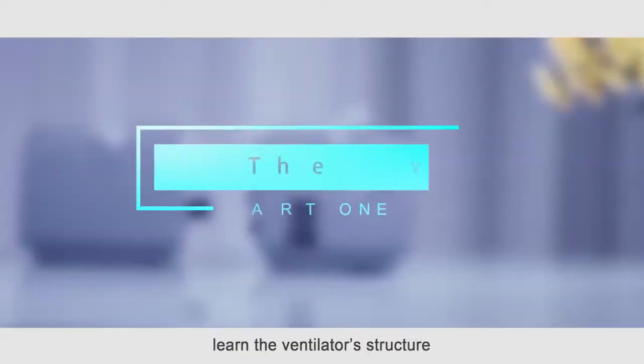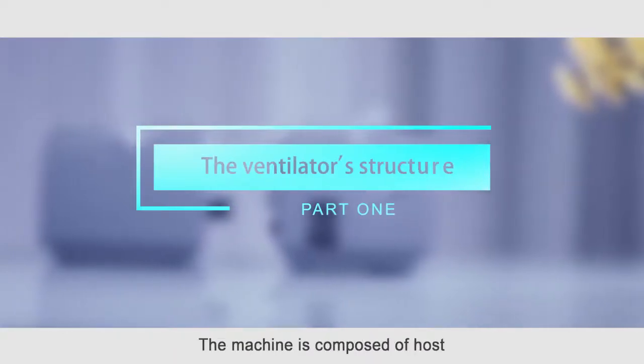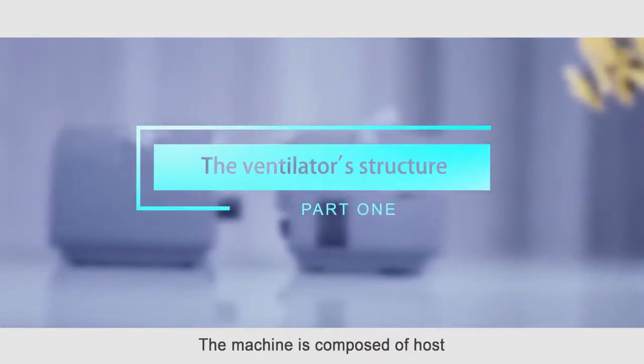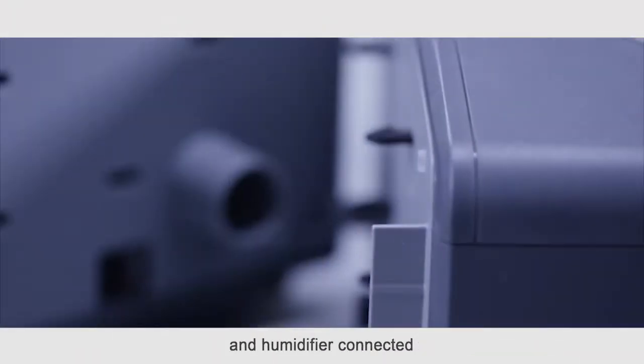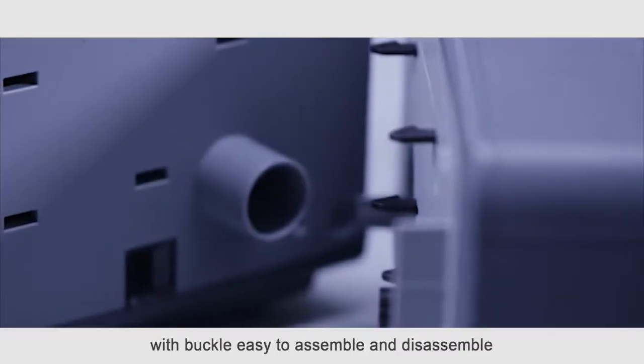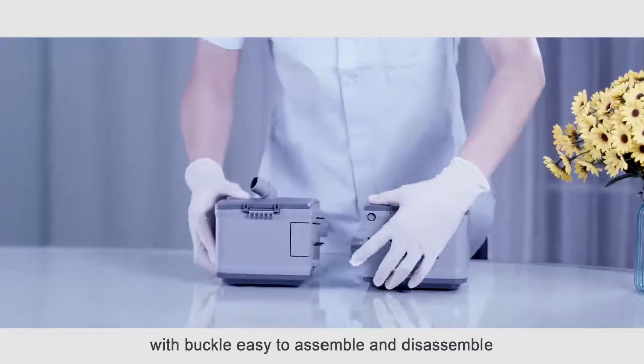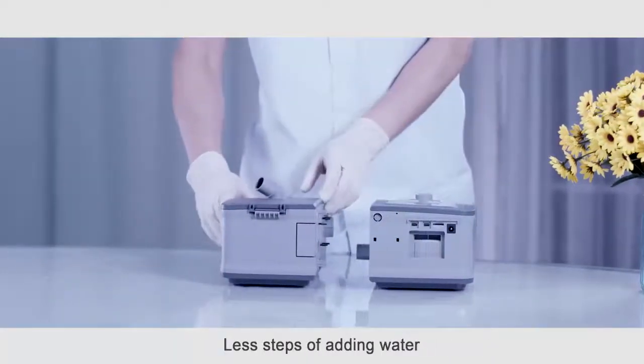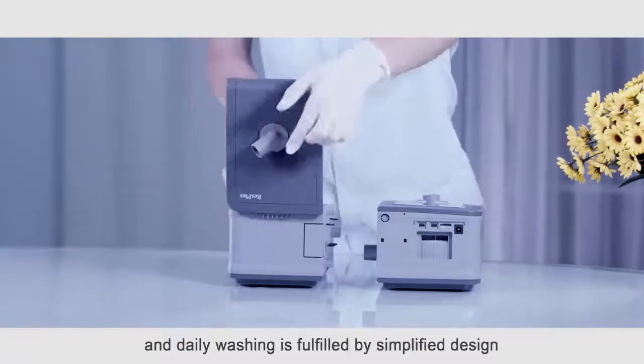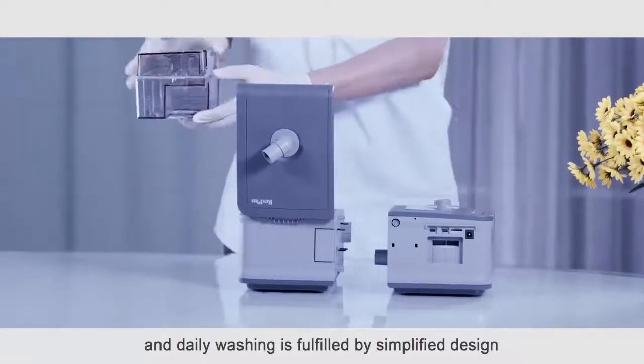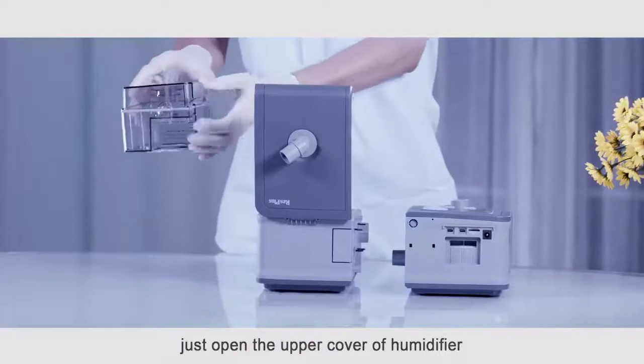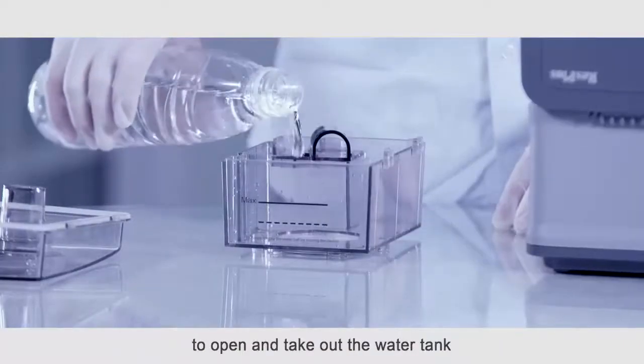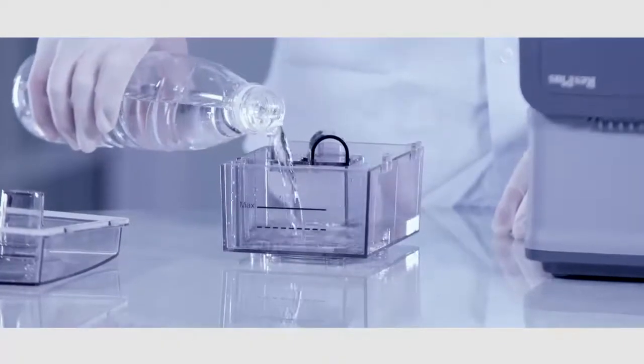Firstly, learn the ventilator structure. The machine is composed of host and humidifier connected with power, easy to assemble and disassemble. Less steps of adding water and daily washing is fulfilled by simplified design. Just open the upper cover of humidifier to open and take out the water tank.